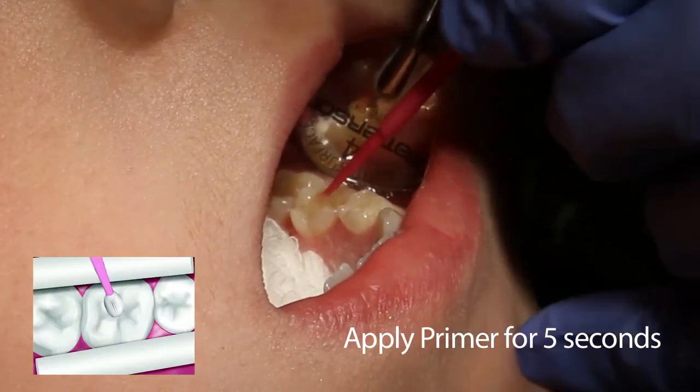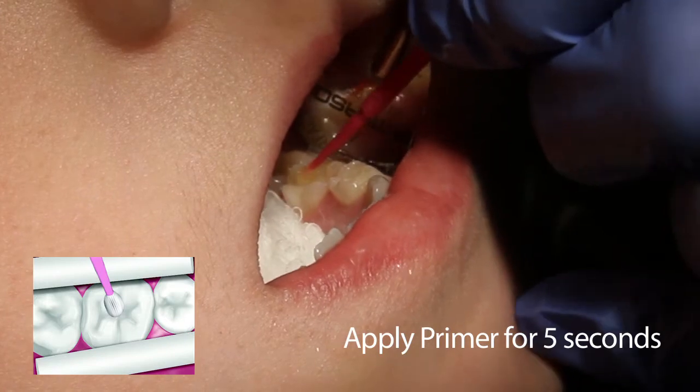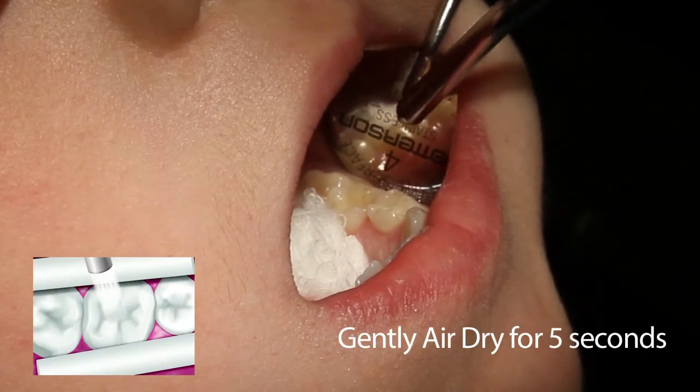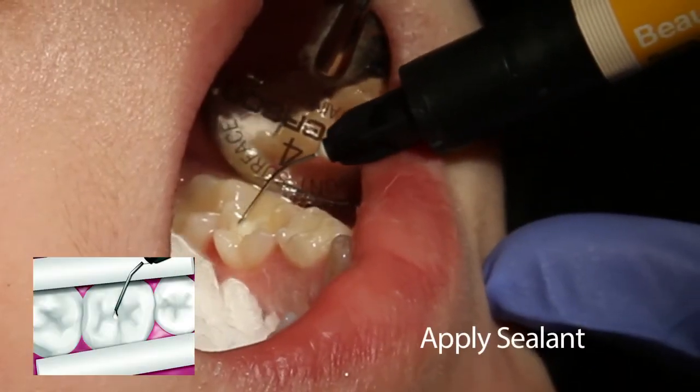After cleaning and preparing the tooth, apply the self-etching primer and let it stand for five seconds. Next, gently air dry for five seconds. After air drying, apply Beauty Sealant.